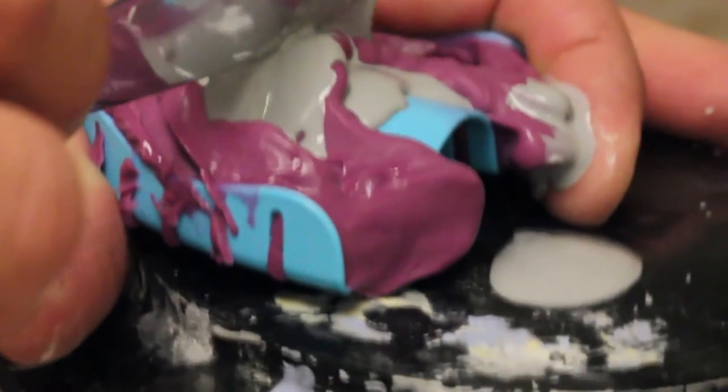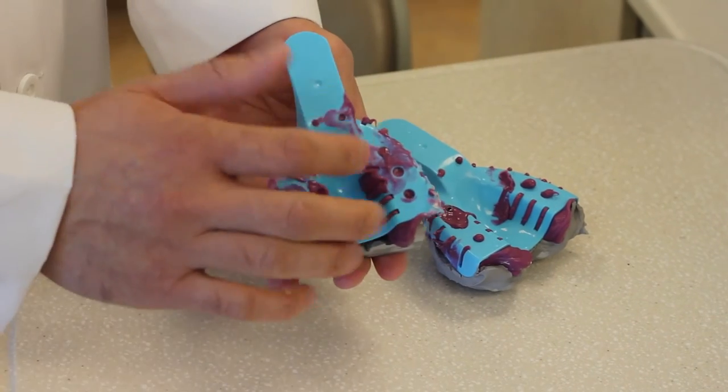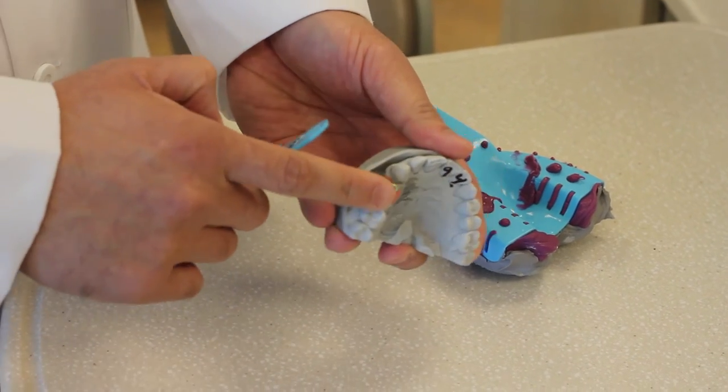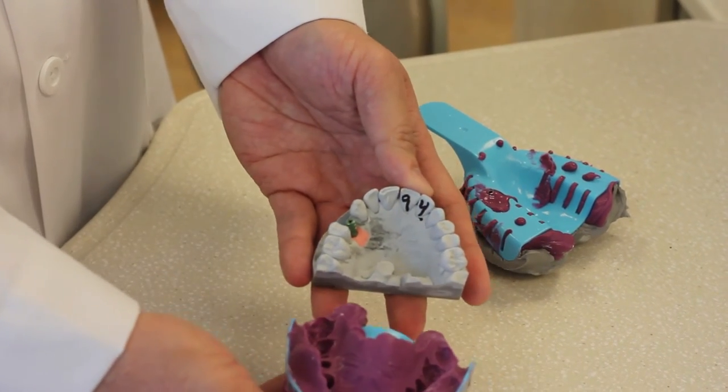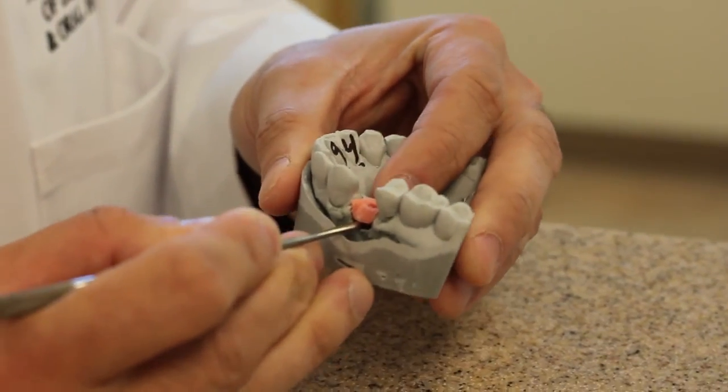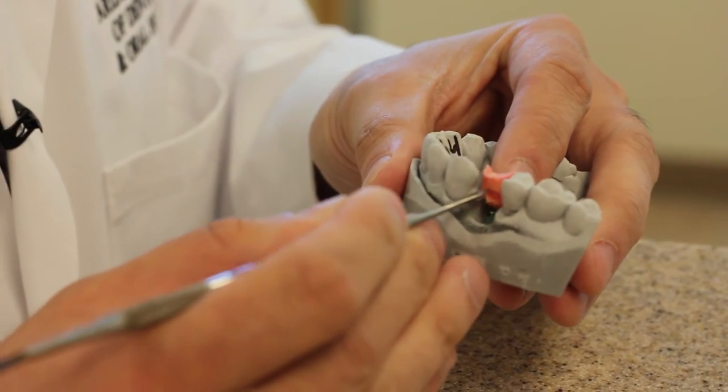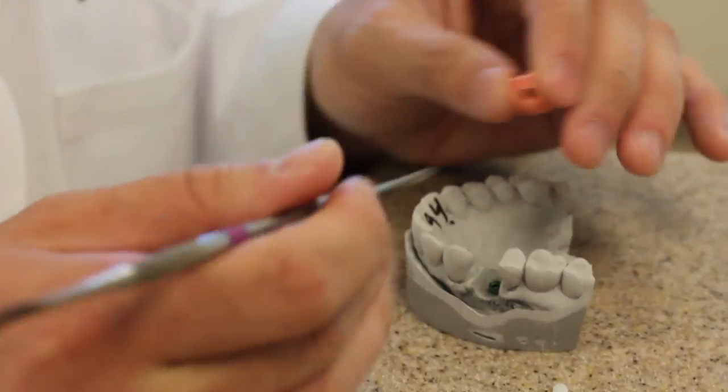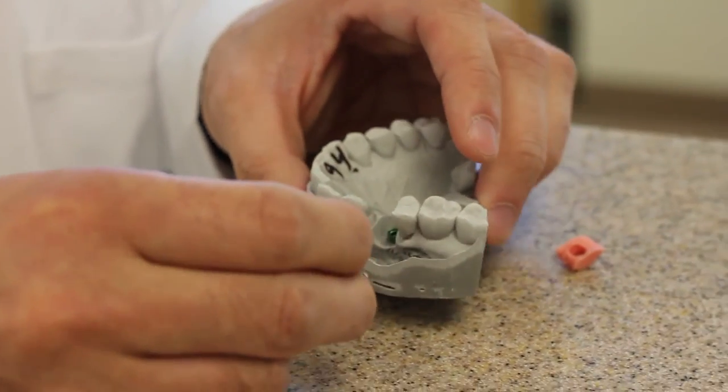At this point, you're going to pour the impression with die stone, just like any other impression. It's important to have the implant analog and coping firmly in the impression with enough materials surrounding it so it's not vibrating a lot during the pour. Once the stone is set, you'll be able to separate it. You can see the soft tissue moulage that's embedded into the stone cast. The soft tissue acts to simulate the soft tissue contours, and it's important to be able to remove it so that we can confirm the seat of any components that go onto the implant.